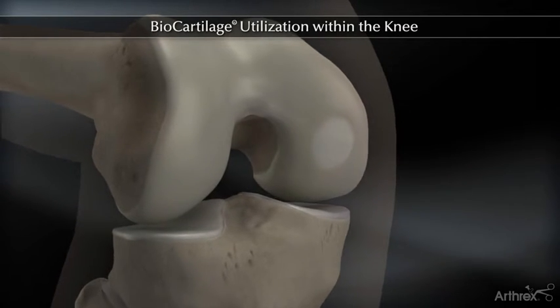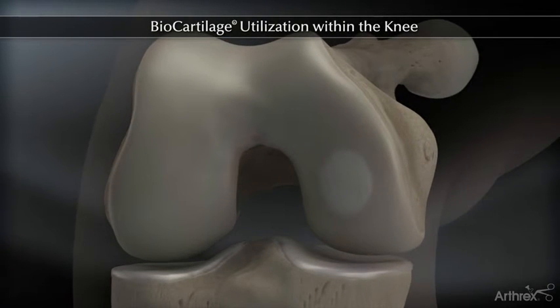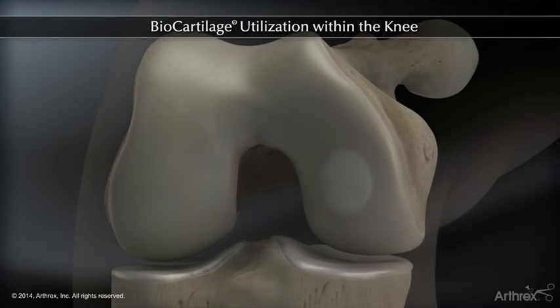Biocartilage provides a tissue network that can potentially signal autologous cellular interactions and improve the degree and quality of tissue healing within a properly prepared articular cartilage defect.